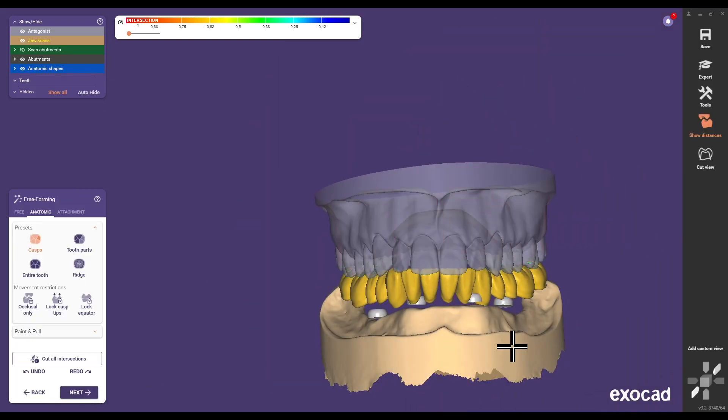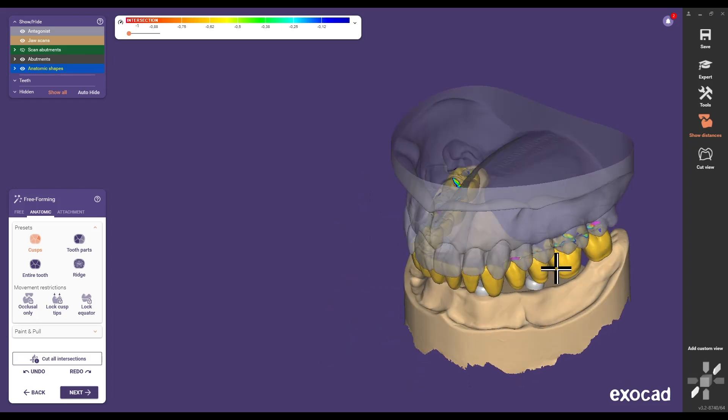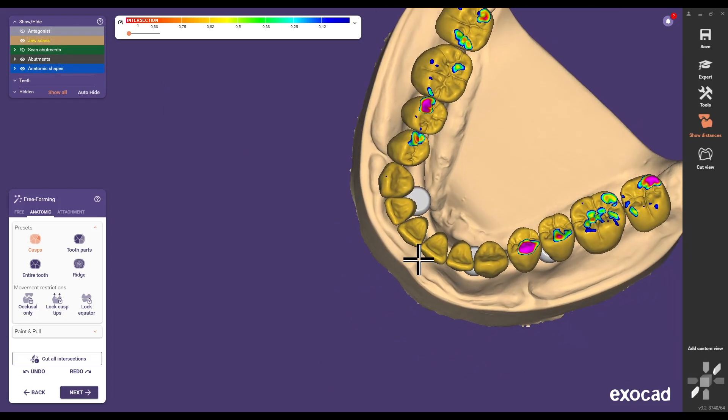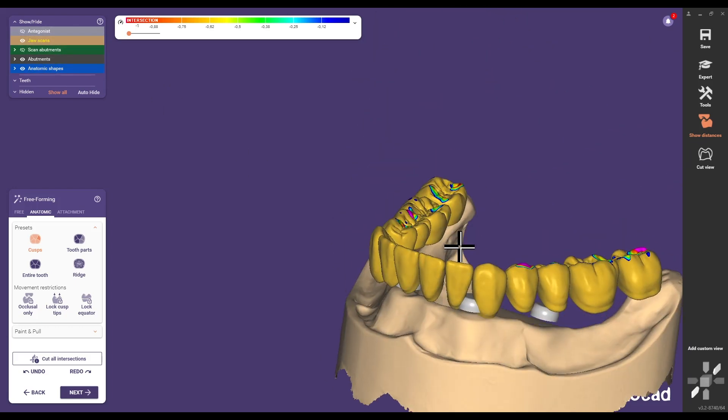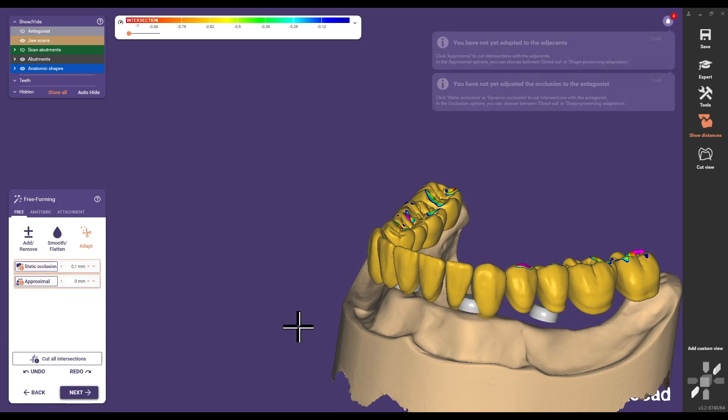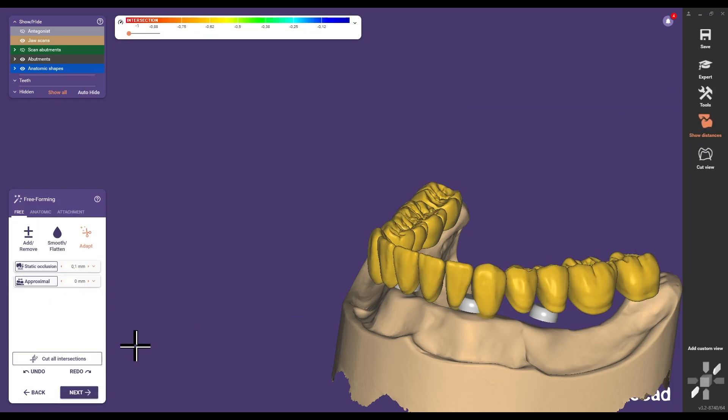In the freeforming step, individually modify teeth by adding, removing, or smoothing. Use the cut intersections function to adjust occlusion according to the antagonist jaw.